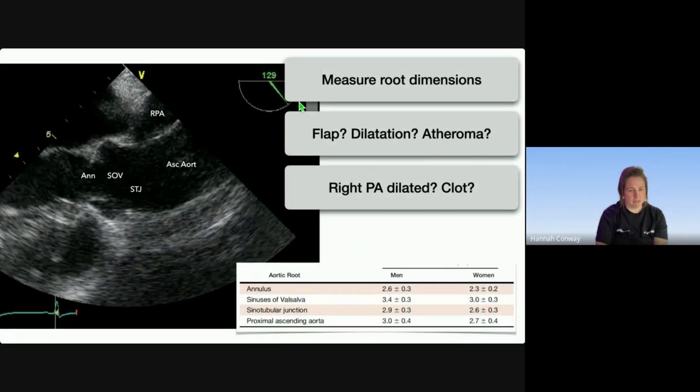Now, in terms of the actual dimensions, again, I've pulled this off the European guidelines, but if anyone's got the EchoCalc app, then they will also be present on there. And I'm a lover of technology and having things in a mobile fashion. So just being able to pull that out and correlate your measurements with these numbers is really helpful. So those are the expected values there.